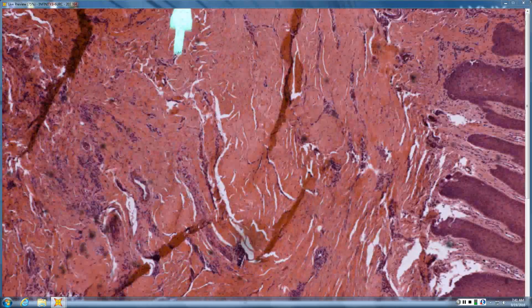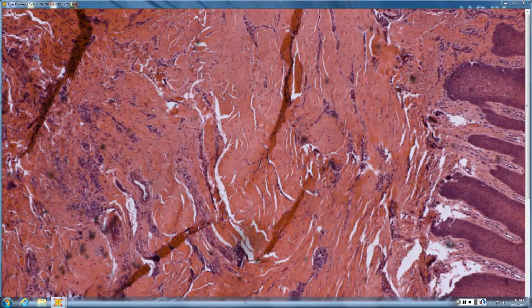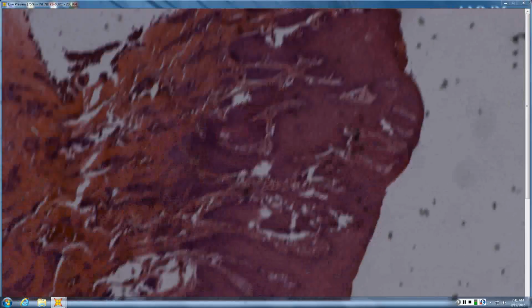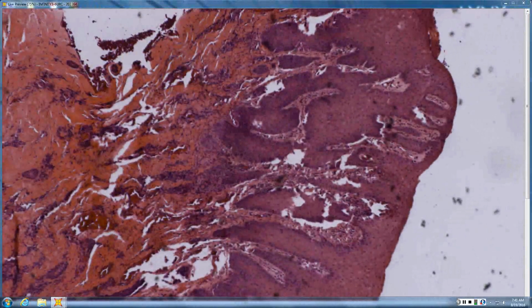You also have a lot of scar underneath. So this is something chronically picked and scarred. Then we'd have to dive a little bit to get to the primary process. The point of the slide is mainly primary versus secondary changes, all the LSC things being secondaries. So, well done.